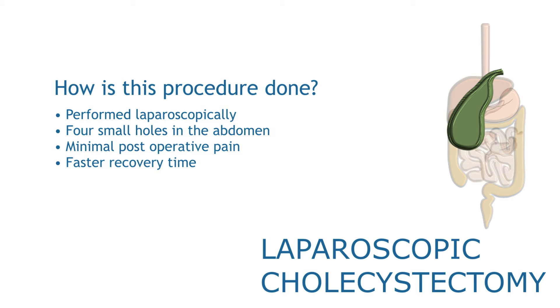If there are no stones present in the bile duct, the cystic duct is divided after sealing it with metallic clips. The cystic artery is clipped and divided, and the gallbladder is removed from the bed of the liver with a cautery device or laser.